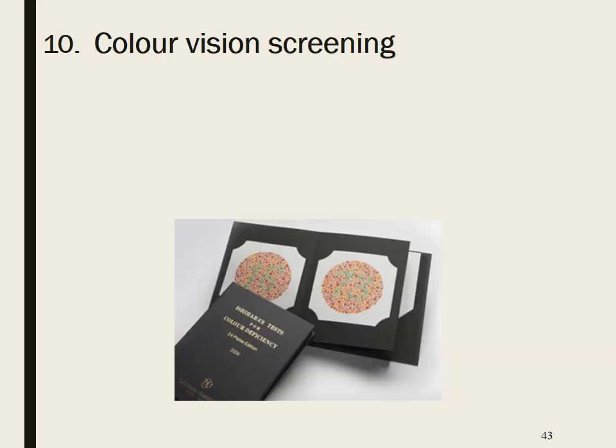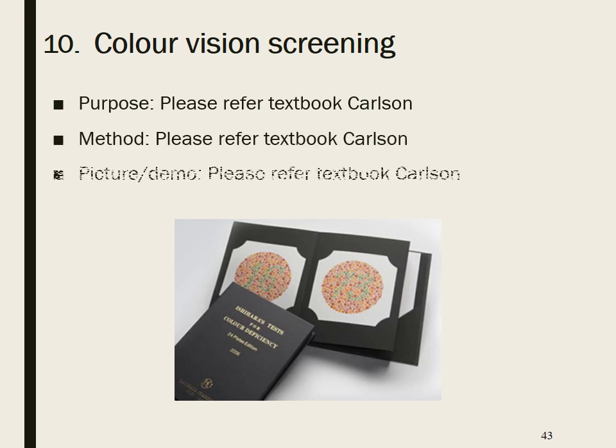For color vision screening, we have a lot of color vision tests, but for screening, we use the Ishihara test. For the purpose, method, and procedure, please refer to the textbook by Carlson. And I also have uploaded the video. Please have a look in iFolio.